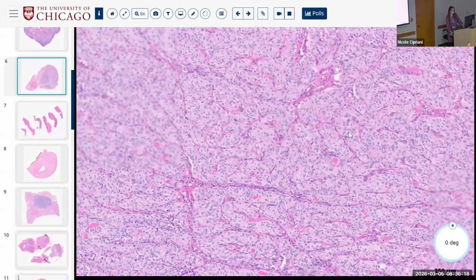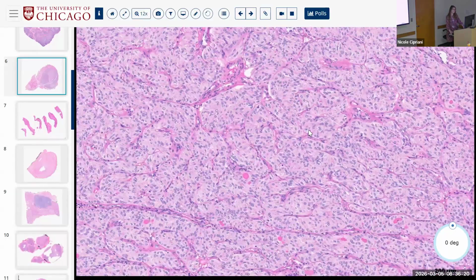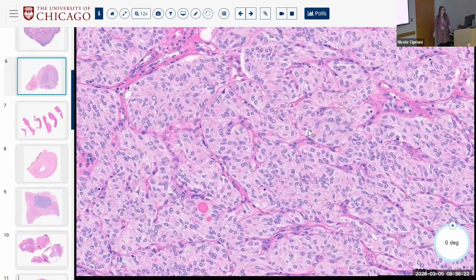However, your point about it being not really papillary, not really follicular, but more solid, right, or trabecular is well taken, right? So this pattern alone is not malignant. This pattern alone is just a pattern. So when we say trabecular, this is what we mean, right?